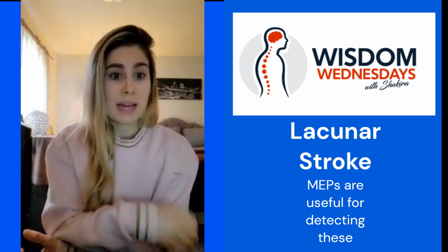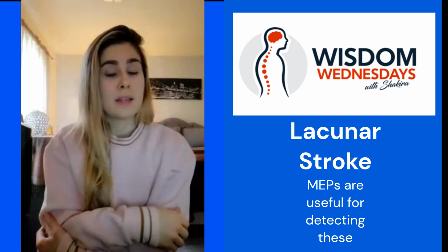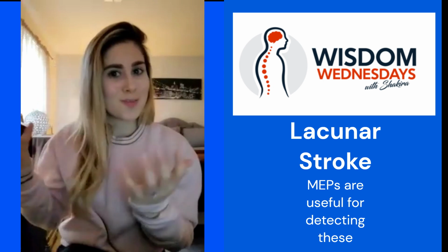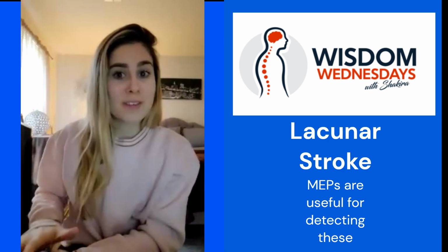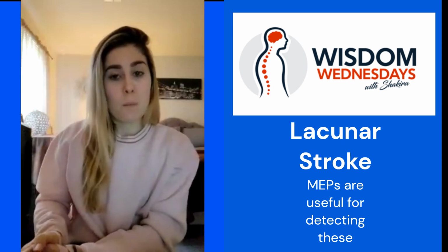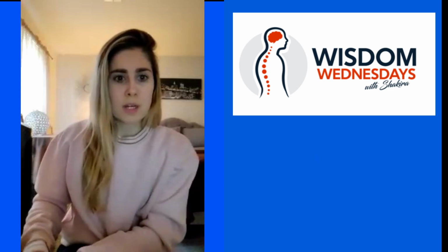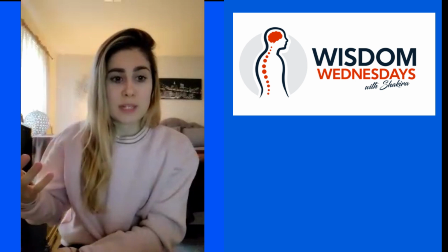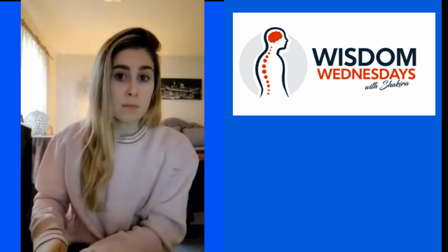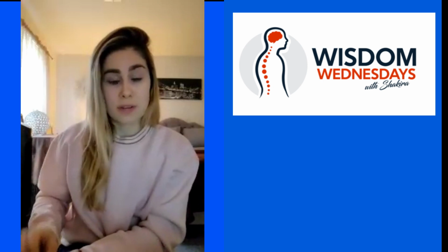So if you're lacking oxygen to these important areas, you're not going to be able to move, and your movement is controlled by your motor evoked potentials, corticospinal tract. So that's why motor evoked potentials are very important to capture these type of deep strokes that might be missed by SSEPs or EEG alone. So since the motor evoked potentials can capture these deep structures of the brain, the addition of them during descending thoracic aortic procedures is very important.